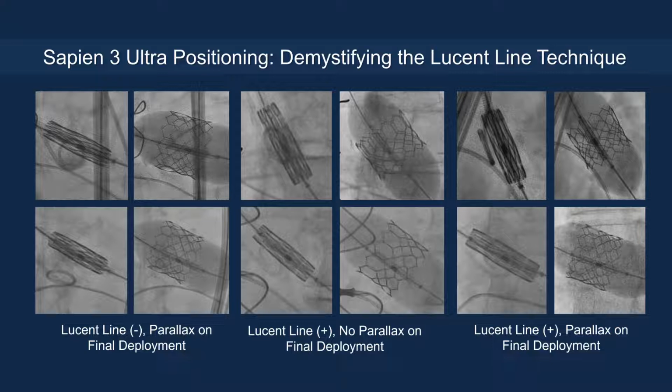Now, in the middle box panel, the 2 different cases, you can see that there is no parallax on the Sapien 3 valve at the positioning.